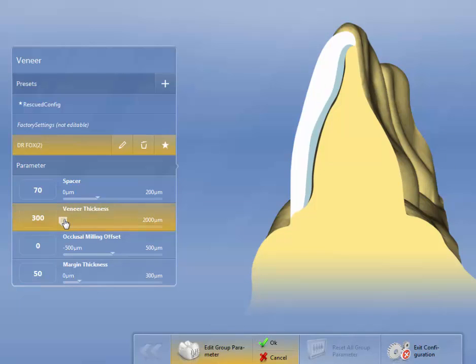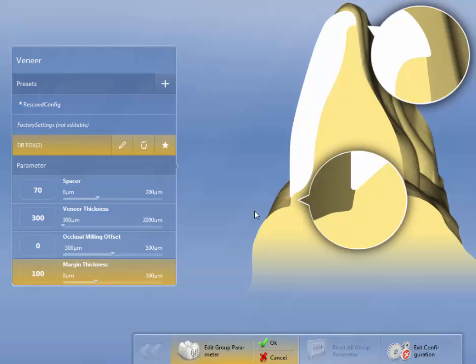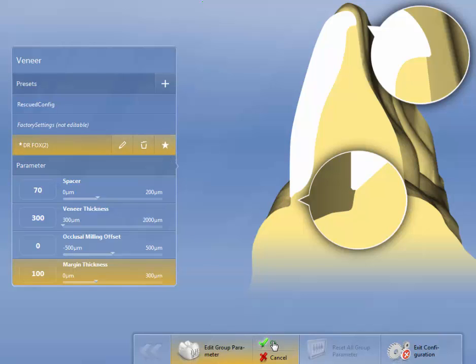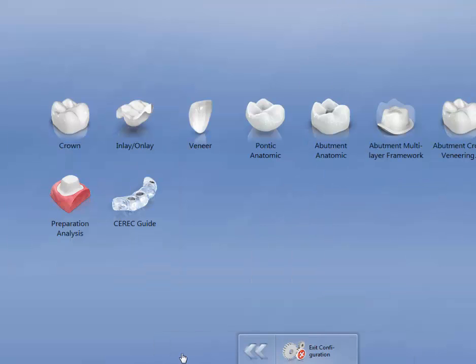Occlusal milling offset, 0. And margin thickness, because I make these thinner, I'll turn this up to 100, and then be able to polish back if there's anything that I can feel with my Explorer. Very easy to do. I'm going to again set this as my favorite, and then hit OK. Go backwards.